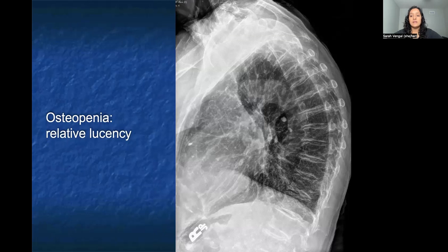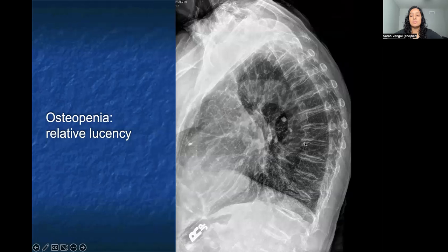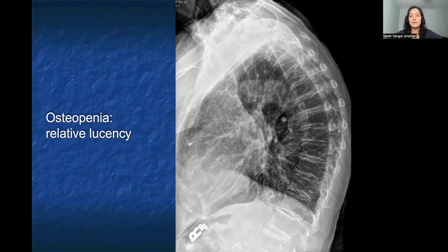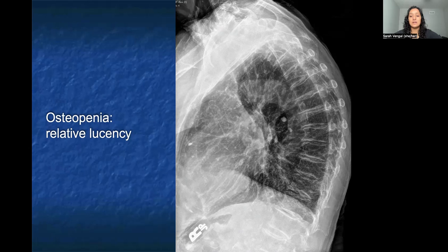In this view of a thoracic spine, we can see something called osteopenia, which is relative lucency of the bone. Compared to the prior picture, you can see that these vertebrae are almost completely radiolucent, except you can still see the outline — which is a sign of lucency or osteopenia on x-rays. Now, x-rays are not diagnostic of osteopenia; you need a DEXA scan to help determine that, but you can see relative or disuse osteopenia on plain films.